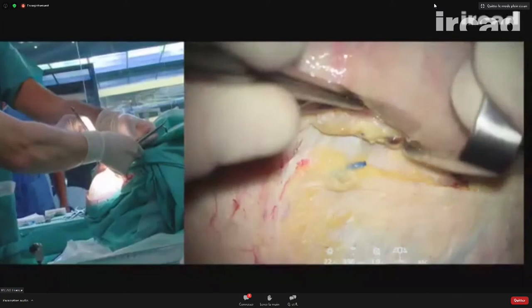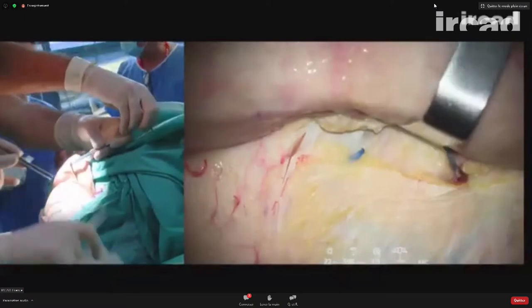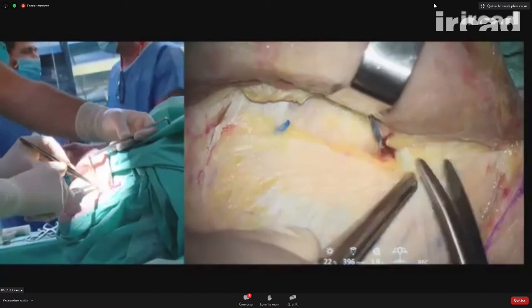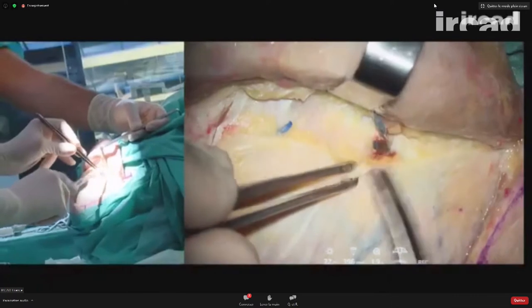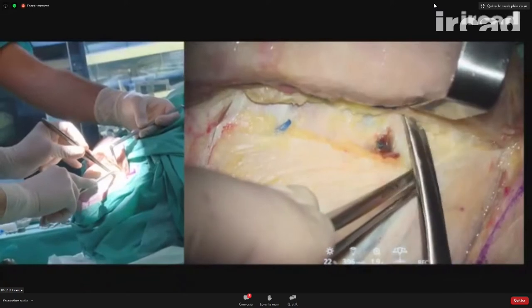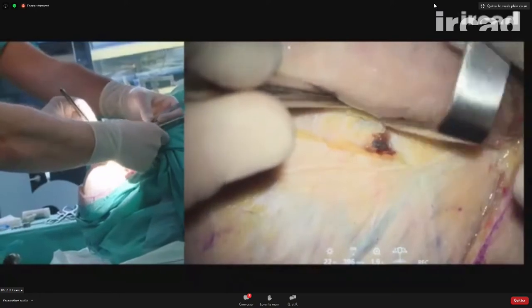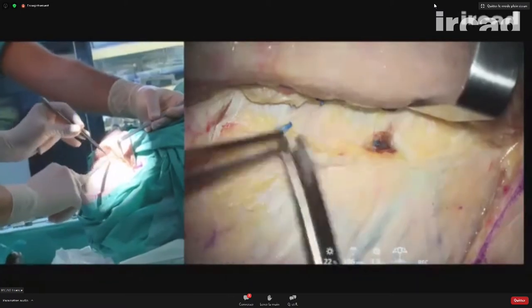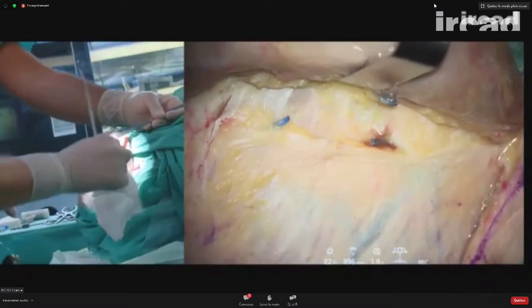This deep fascia is extremely important because when I follow it anteriorly, I can find the bone of the lateral margin, the lateral rim of the orbit. I cut this vein. And here is the same. Okay, so this is interfascial dissection. Now I can retract my skin much more anteriorly.